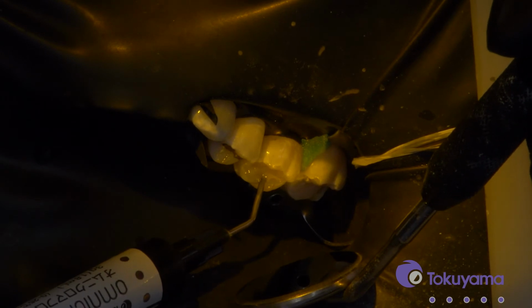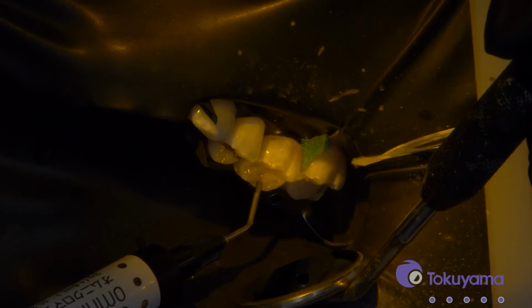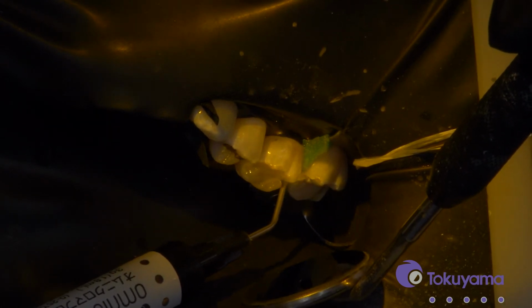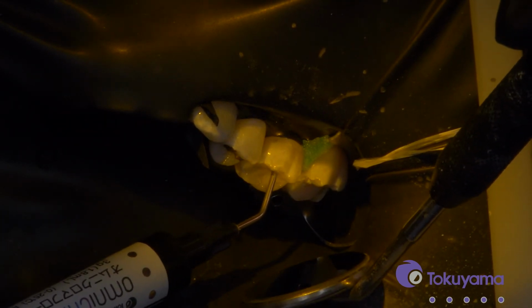As I said, when you place the material, keep the tip embedded with the material and kind of fill from there. If you move the tip around too much, you may incorporate air bubbles. And we don't want that. No voids in our restorations here.